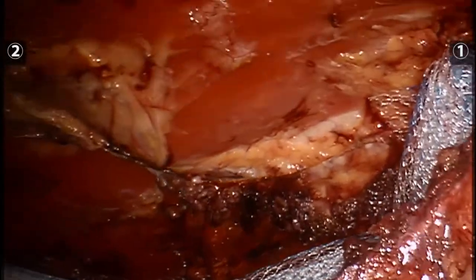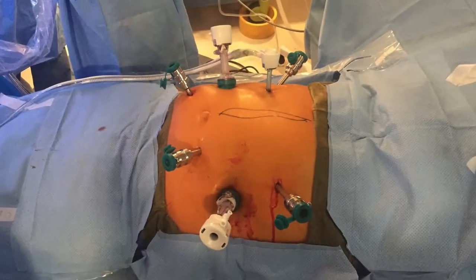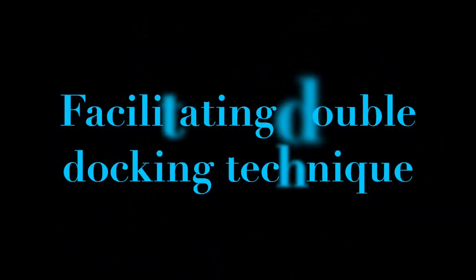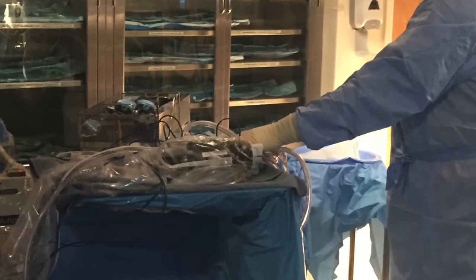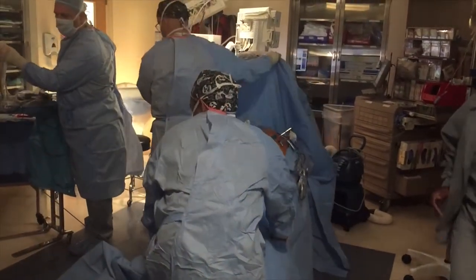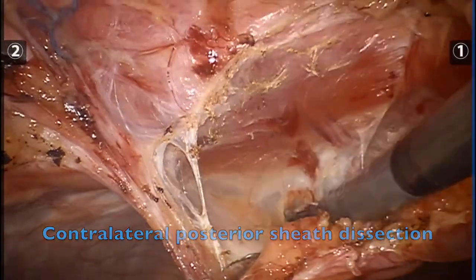We then place mirror-image trocars on the contralateral abdomen and undock the robot. Here is an external view of the trocar positions. All cords and camera are taken off the patient and placed on a Mayo stand. The patient is turned approximately 180 degrees and the robot is redocked. Contralateral dissection is performed in a similar manner.